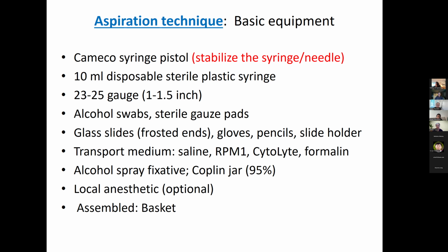Local anesthetic is really not required unless the patient is nervous, and you might have to try to dissuade them from using a local anesthetic, because the prick from the local anesthetic is another process. So you could probably avoid it. All of this material can be assembled in a basket, and it occupies very little counter space.